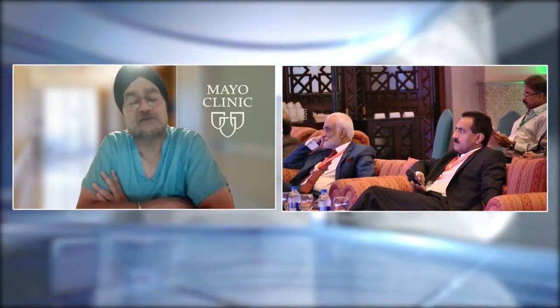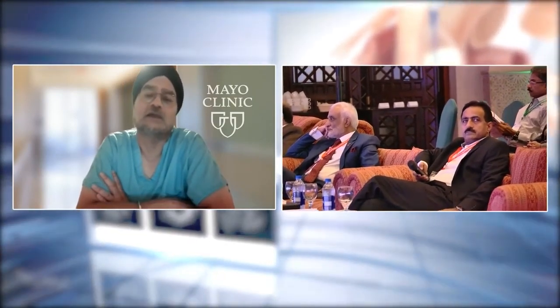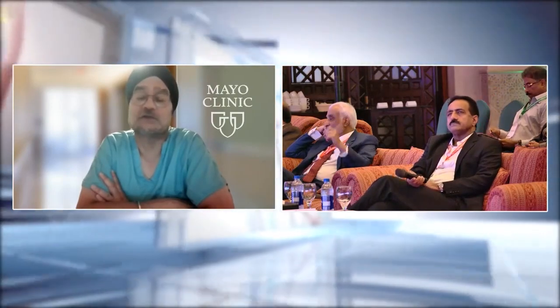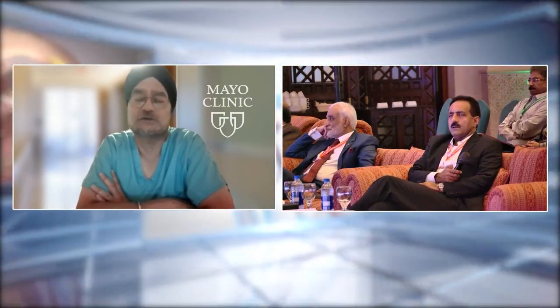Each of these valves, the self-expanding valve and the balloon expandable valve, has a significant learning curve at first. There are many tips and tricks that are necessary to get them in there. But we tend to favor the balloon expandable valve because of the ease of deployment, the lower PVL rate, and the lower pacemaker rate. There are some circumstances, however, where we may favor a self-expanding valve, such as valve-in-valve implantation for bioprosthetic aortic stenosis.